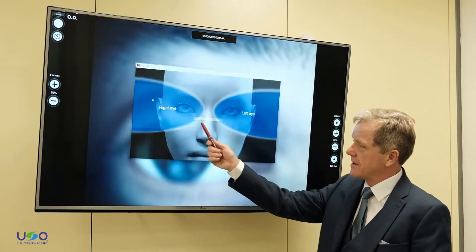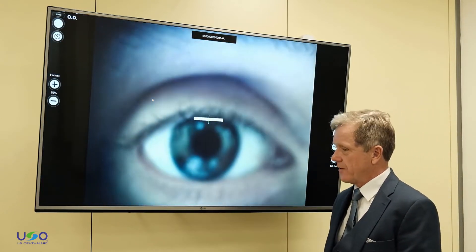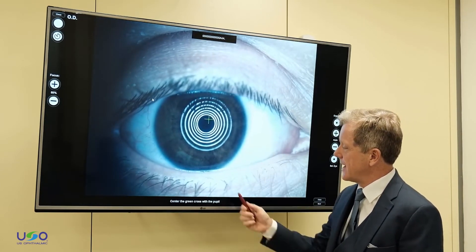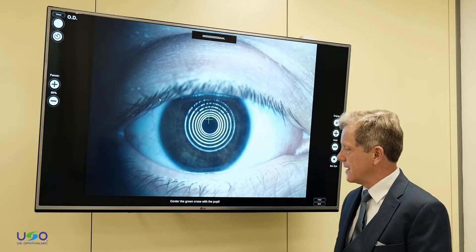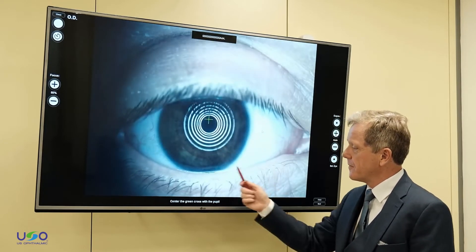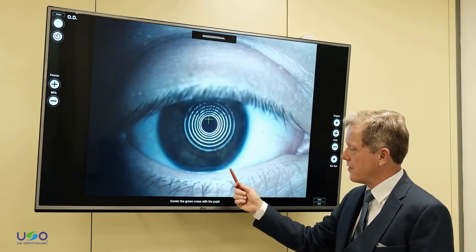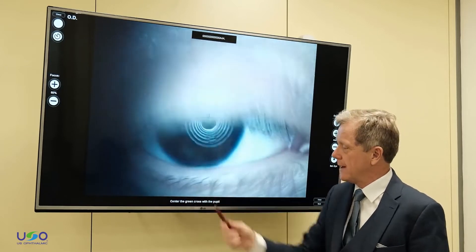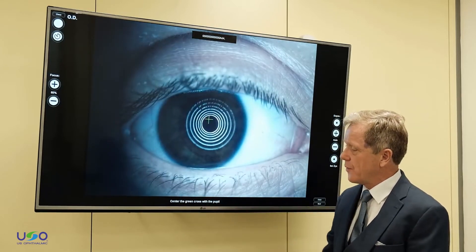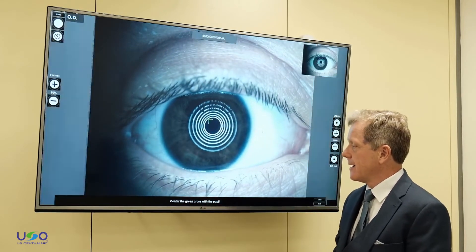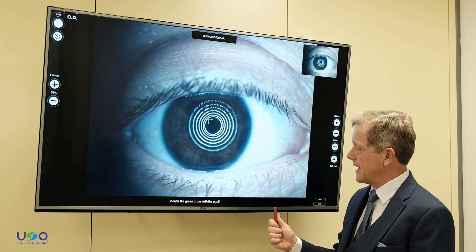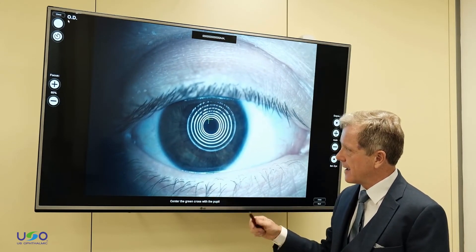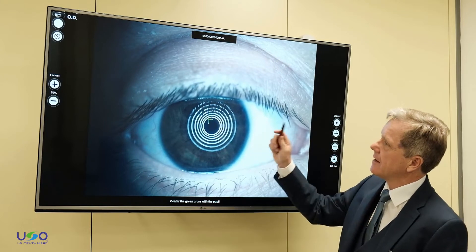We ask the patient — we'll do it on the right eye here — to look straight ahead and just keep blinking. It's important to focus on the image, either through the internal focus within the software or on the hand device. We're measuring that, then we select an image and close.